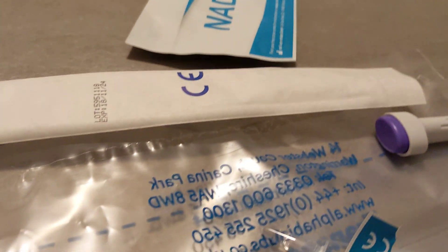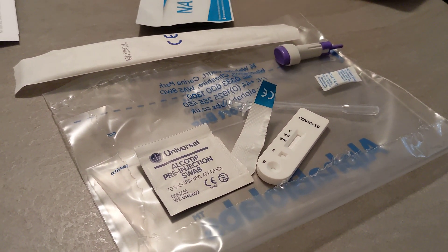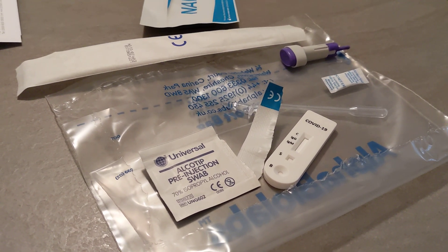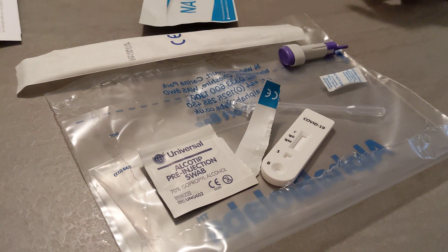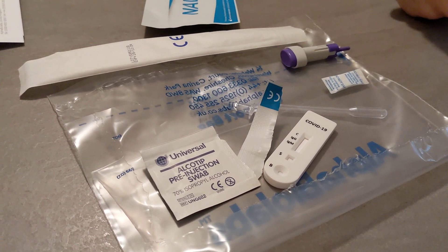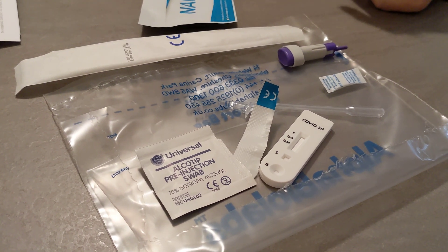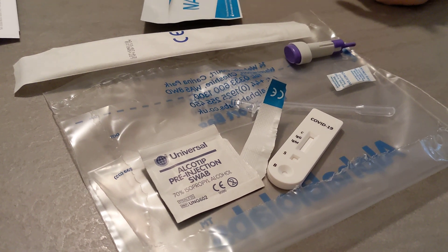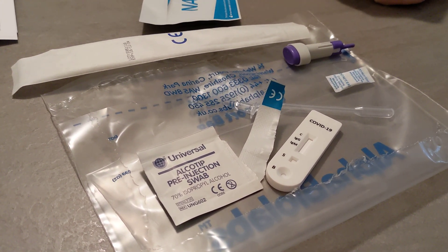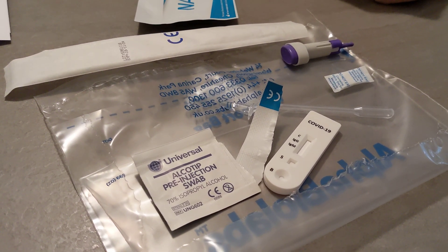So again, it's pretty straightforward. I really encourage everybody to get one because they're doing a fantastic job in providing the kits. If you just want to order it and keep it at home just in case and you don't want to wait to get a test, then I strongly encourage you to get one of those kits. They're pretty useful.